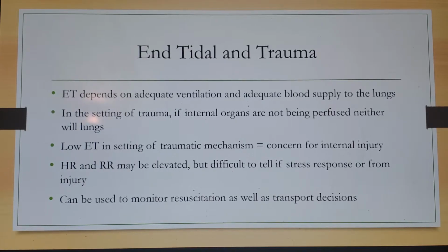Also, it can be used to monitor your resuscitation. So if their end tidal is improving with fluid resuscitation, or if you're one of the services that gives blood products as well, then you can use that to guide your resuscitation, and also use it to guide your transport decisions. Obviously, around here, most major trauma goes over to U of L, but if you have a patient you're on the fence about that has a low end tidal CO2 in the setting of trauma, that certainly would influence your decision to go to a level 1 trauma center.